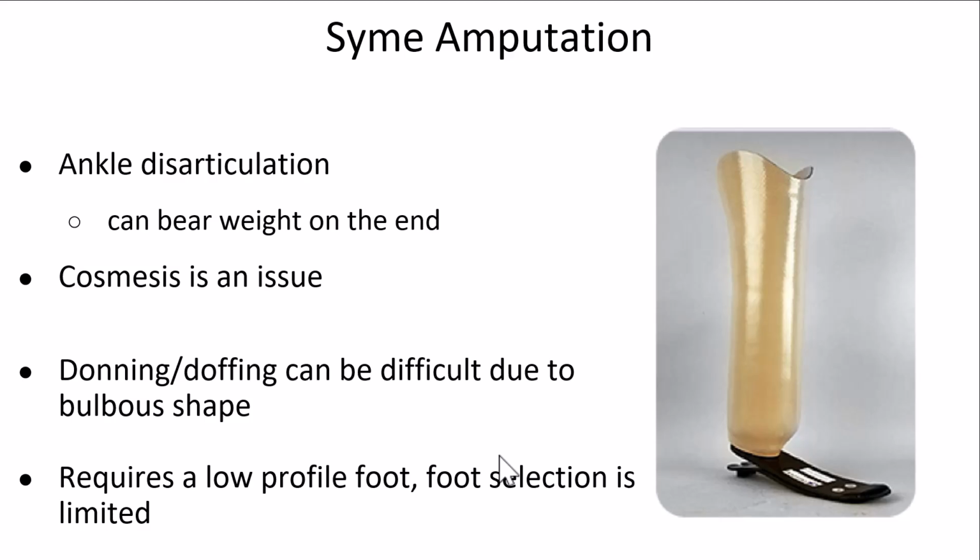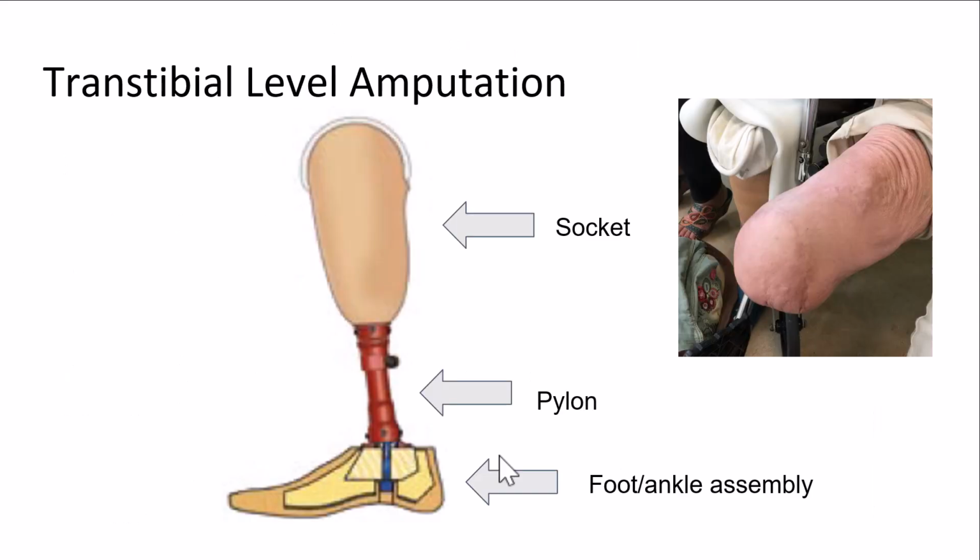It also requires a very low profile foot, and the foot selection overall is limited. As you can see, nothing very fancy about the kind of foot that's appropriate for a person with a Syme amputation. Somebody's had a transtibial level amputation.